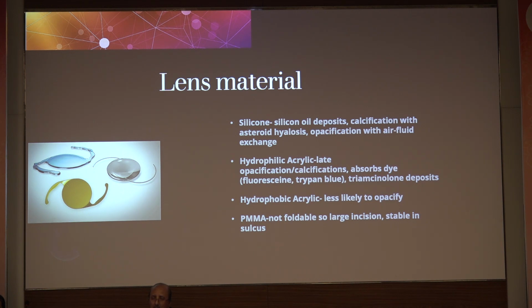Hydrophilic acrylic IOLs lead to late opacification and calcifications. They also absorb the dyes. That is, you might see a blue lens in the eye. So you might wonder what it is. That probably is due to the hydrophilic acrylic material which has absorbed the trypan blue dye and given it a blue color. They also sometimes absorb the Kenacort or the triamcinolone deposits.